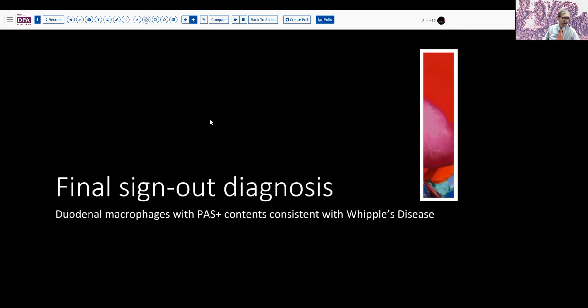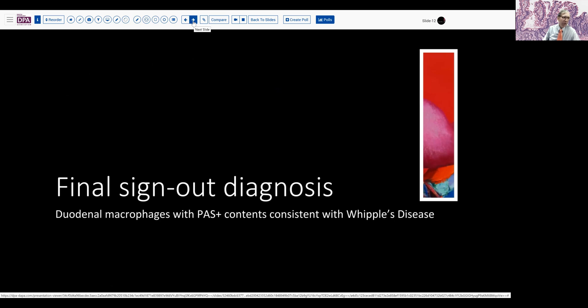That summarizes our final sign out here: duodenal macrophages with PAS positive contents consistent with Whipple's disease. We would have recommended PCR testing for further evaluation of this patient. And treatment, as indicated, would have included dual antibiotics to achieve a cure. Recurrences are common with Whipple's disease, especially in the CNS, and so a close follow-up is useful to make sure that the patient has fully responded to treatment.